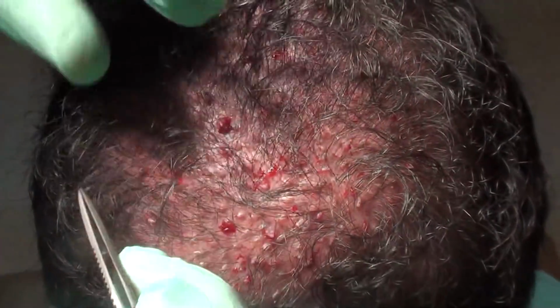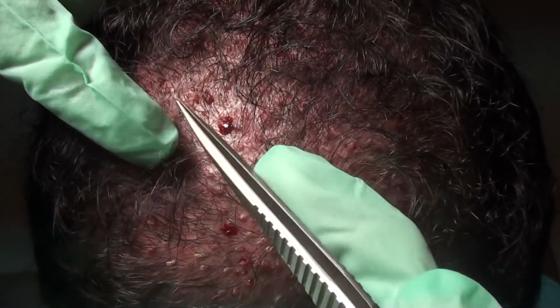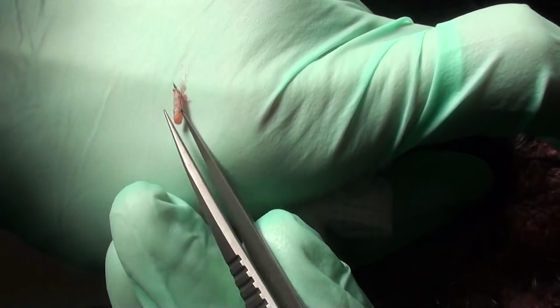And if you want to get a feel for what a graft looks like, let's take one of these guys out. Okay. So here's a graft that just came out. These little black dots are the bulb of the follicle. If you look at it from the top, you can see there's about 2 or 3 follicular units in it, and each little separate dot's a hair. 1, 2, 3, 4, 5, 6, 7, 8 hairs in that one particular graft.